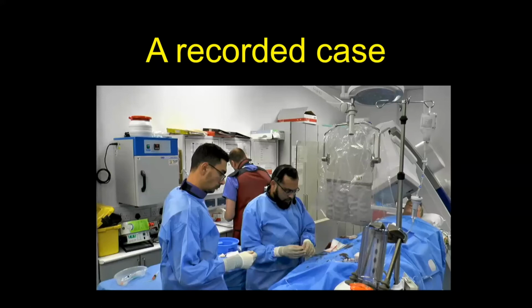So you're right, Farhan, that for 99% or 99.9% of the cases, that would be the strategy. But in very selective cases, if you have managed to achieve good flow, there is no residual stenosis, and there is only a bit of plaque erosion and plaque rupture, and you want to leave it, I think that's reasonable as well. Okay, I think so.